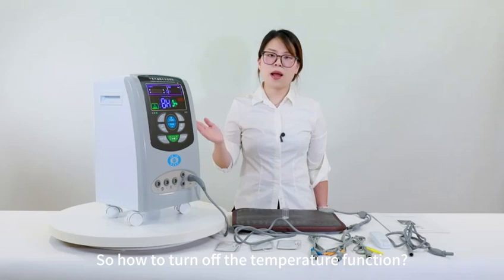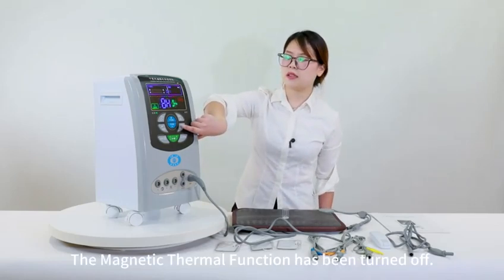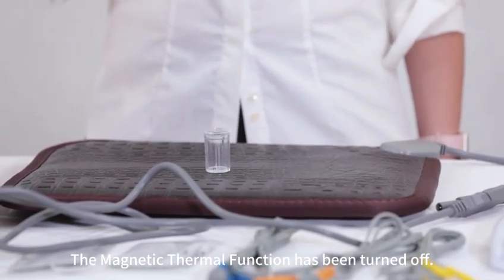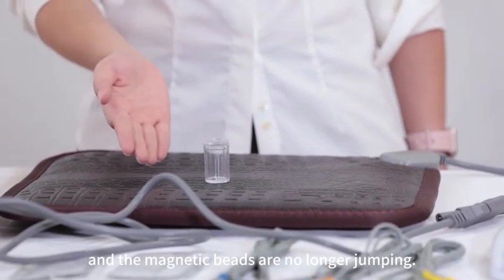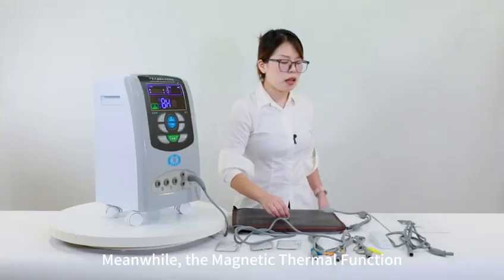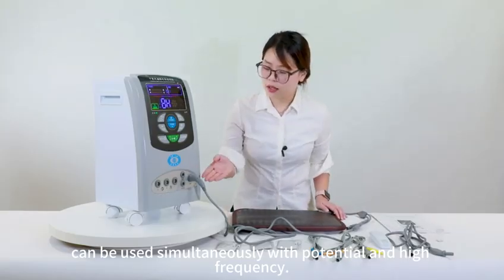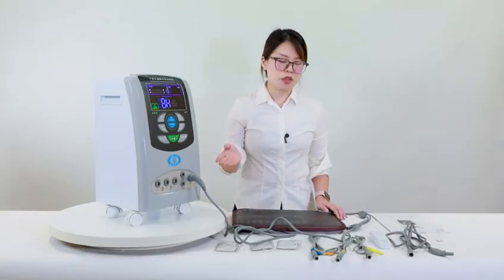So how to turn off the temperature function? Just click it again on the operation panel. The magnetic thermal function has been turned off, and the magnetic beads are no longer jumping, which proves that the function is turned off. Meanwhile, the magnetic thermal function can be used simultaneously with potential and high frequency.